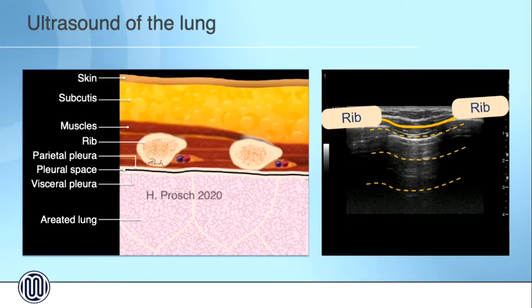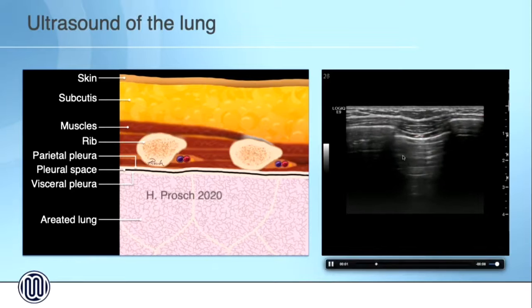And if you look now at the moving lung, you will appreciate that although the surface of the lung is pretty smooth, there are some irregularities leading to these lines radiating from the pleura towards the lung parenchyma, which is normal. Just a few of these lines are seen in each and every person, and these are called B lines.